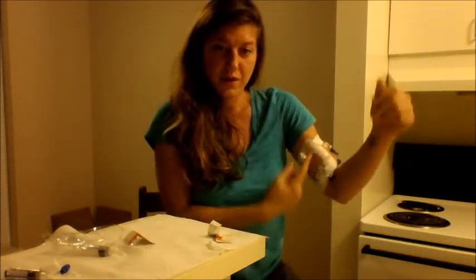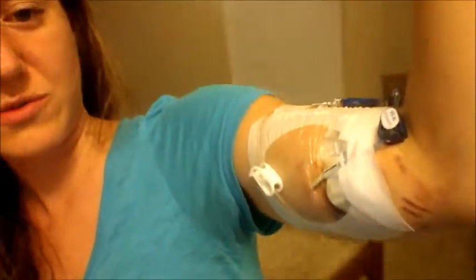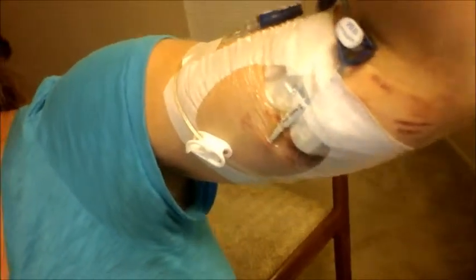I just swivel mine around. I wanted to show you guys what the nurse did to me — she really jacked me up. That's not normal. Your arm should not look like this. If your nurse does that to you, or whatever that lady was — PA, Physician's Assistant — that sucks because this sucked. But that's how you infuse. That's the second half of SASH with the pump for Rocephin, or Lyme Protocol for Dr. Lerner.